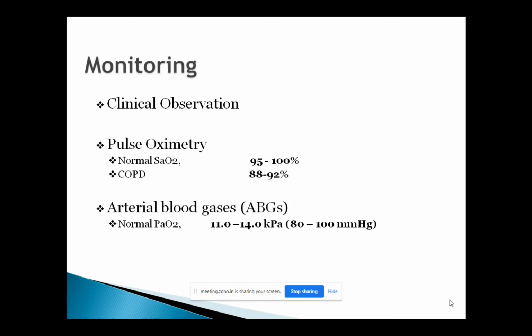When a patient comes to accident and emergency or casualty, that's where most of the time the oxygen is started if there is a need, or maybe in the ward. Most of the time, this is determined by pulse oximetry. Pulse oximetry is a very small device. You put it on your finger, which tells what the patient's saturation level is, because the pulse oximeter measures the oxygen flow in your finger, and then it converts it into a percentage. So the normal saturation is 95 to 100, and for COPD patients, 88 to 92.